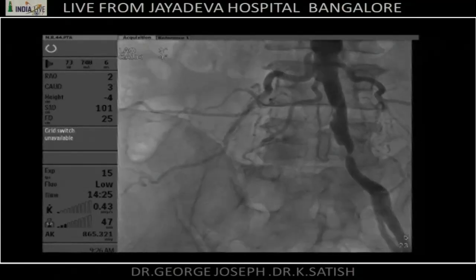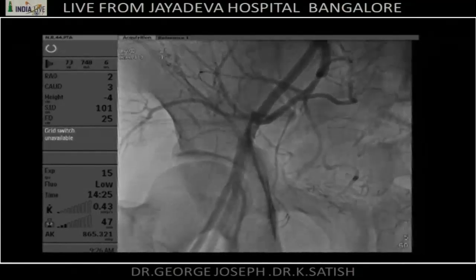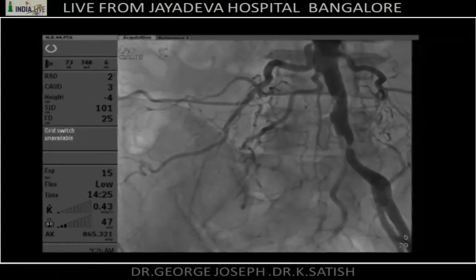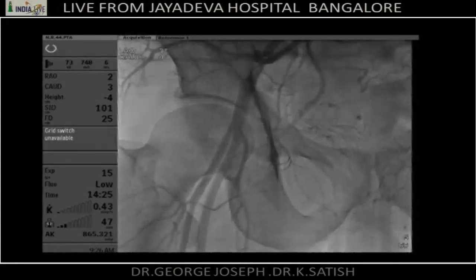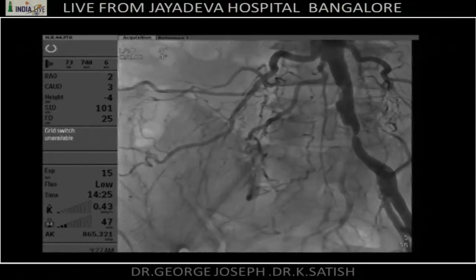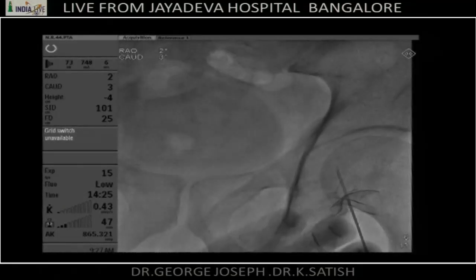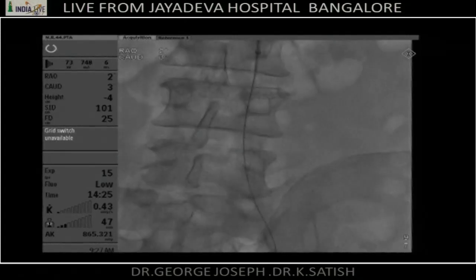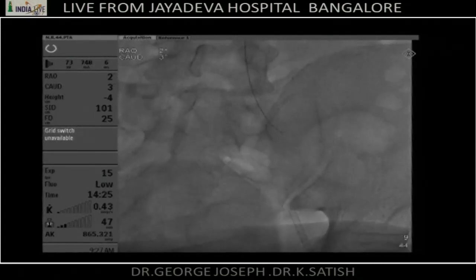Right, so we've got our accesses. We have bilateral femoral arterial accesses in addition to the left brachial, and I have passed a wire up the left side into the aorta and dilated that very focal stenosis in the left common iliac, because any catheter or anything indwelling there would cause ischemia while we are waiting. So we just dilated that focal stenosis with a 6 millimeter balloon.